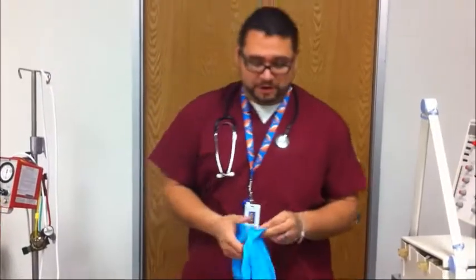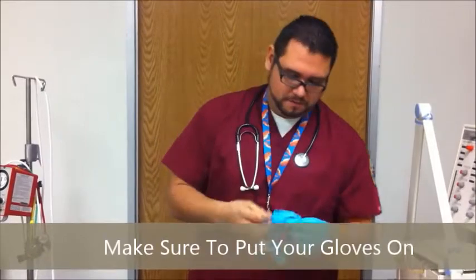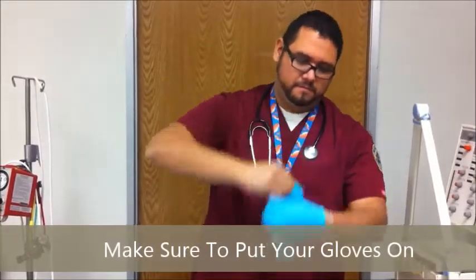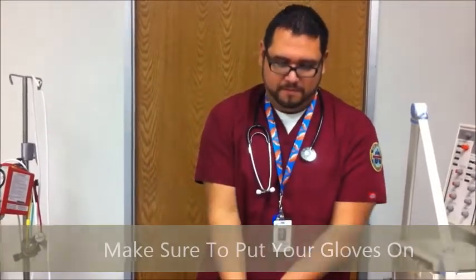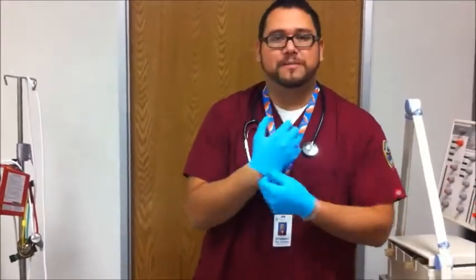After washing your hands, we're always going to make sure we wear our gloves. Now let's go check on the patient.